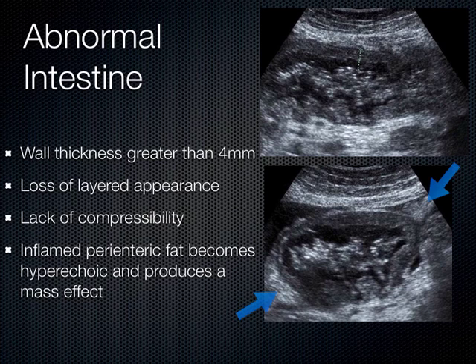Now, intestines should easily flop around each other and slip around each other and should slide amongst one another. When there's inflammation or abnormality there, then it all moves together like a unit. And this is an example here of a patient who had pseudomembranous colitis.